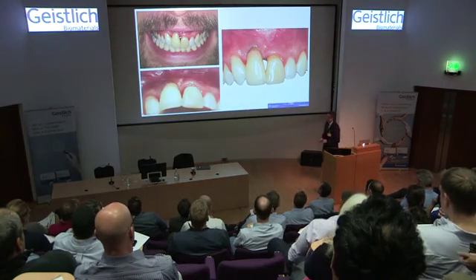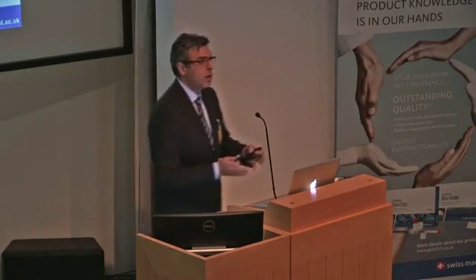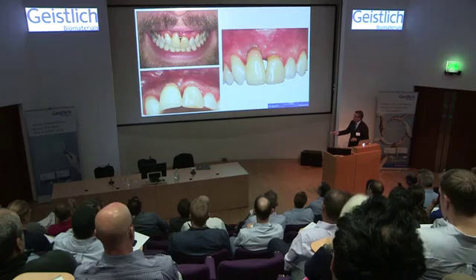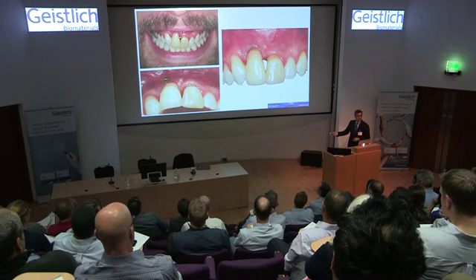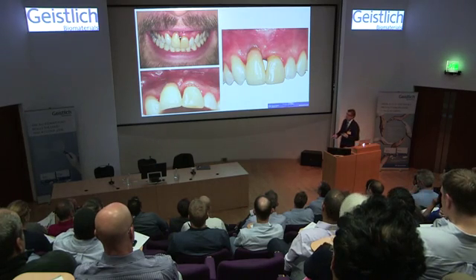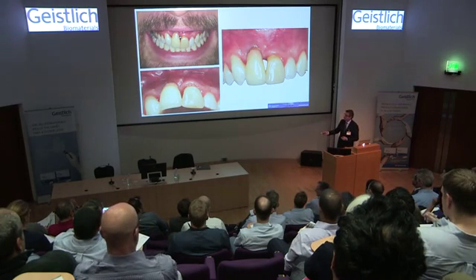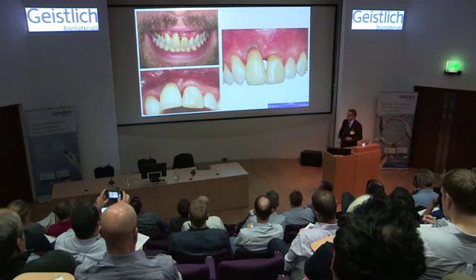And if there is one message that I want to send out today, because whatever I'm going to talk about today is only and only going to work if we get our implants in the correct three-dimensional position. So that's the first message of the day from me, is everything will work only if your implant is in the correct three-dimensional position. And you'll see this implant is way beyond its buccal envelope.